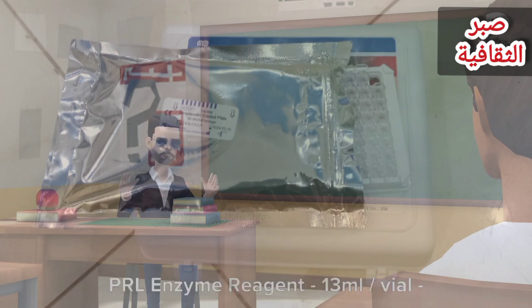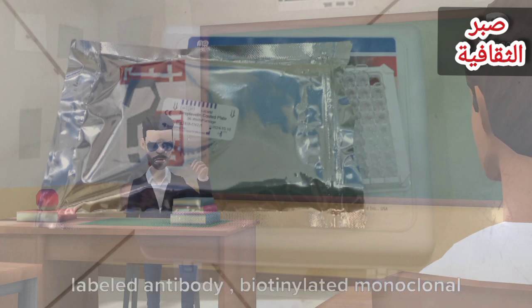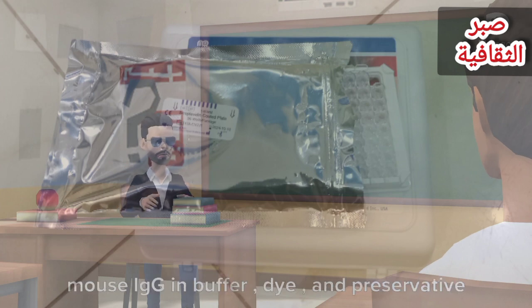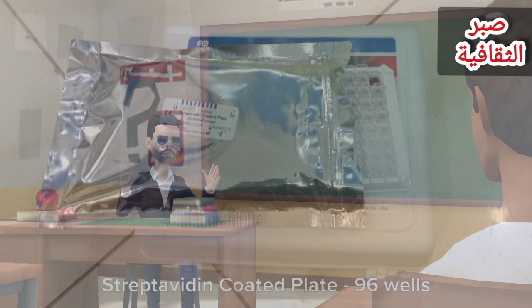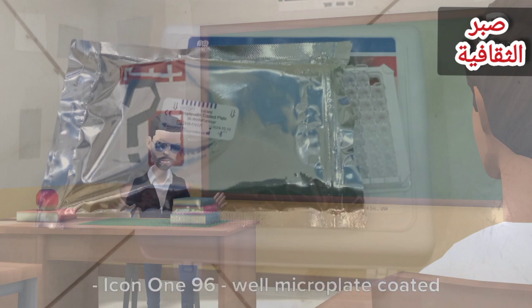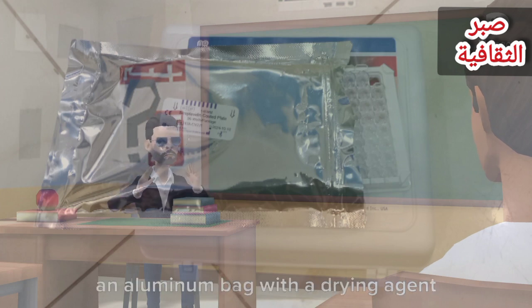Third IS 84/500. B. PRL enzyme reagent, 13 ml/vial, icon E. One vial containing enzyme-labeled antibody, biotinylated monoclonal mouse antibody, buffer, dye, and preservative. Store at 2-8 degrees C. C. Streptavidin-coated plate, 96 wells. Icon: one 96-well microplate coated with streptavidin and packaged in an aluminum bag with a drying agent. Store at 2-8 degrees C.